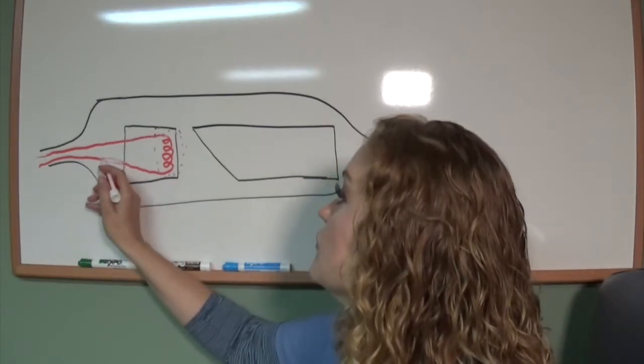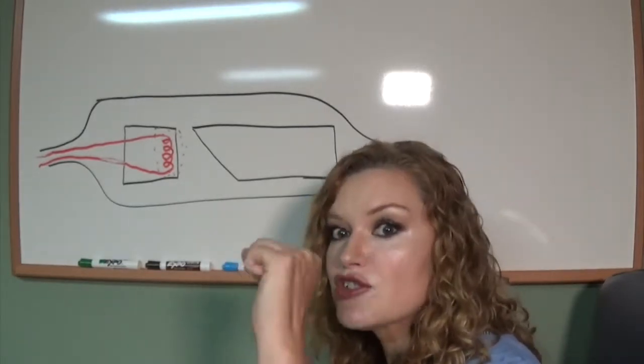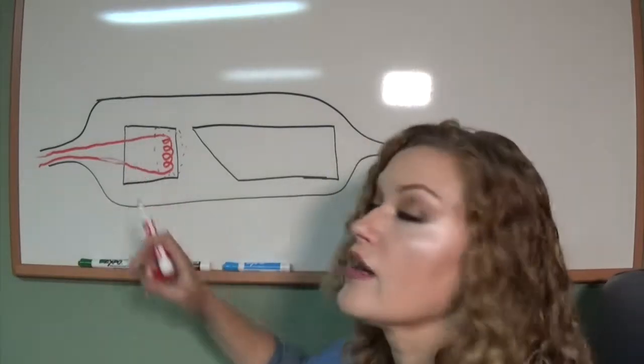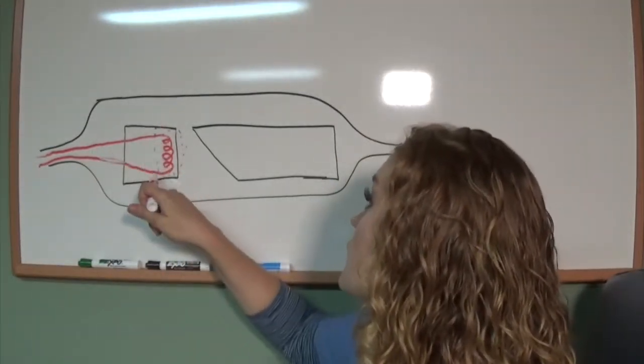However, I can prove this to you that electrons do come outside of the wire. If you put your hand on an unshielded wire, you're going to feel like an electrocution sort of situation. That's the electrons going through your hand. They don't stay necessarily in the wire. That's why you always have shielded wires. But in here we don't have a shielded wire. We want them to make this electron cloud.